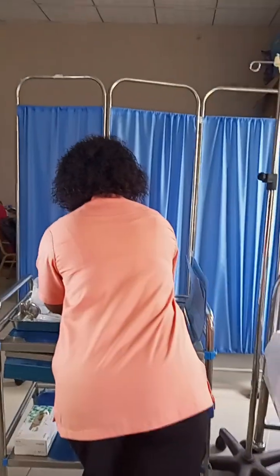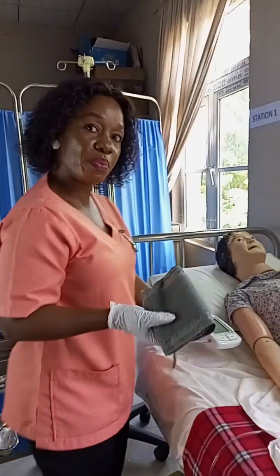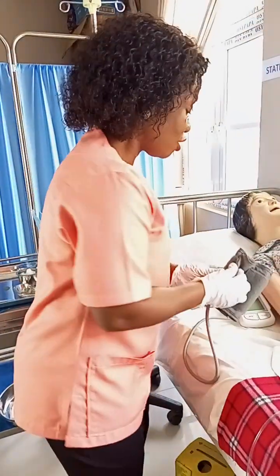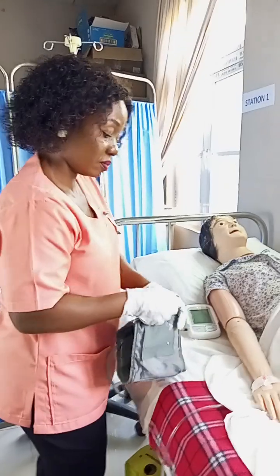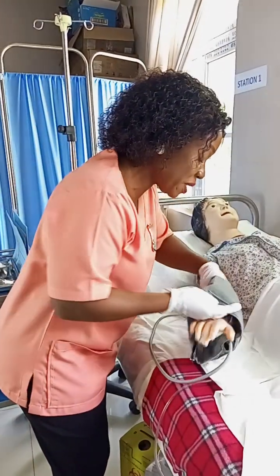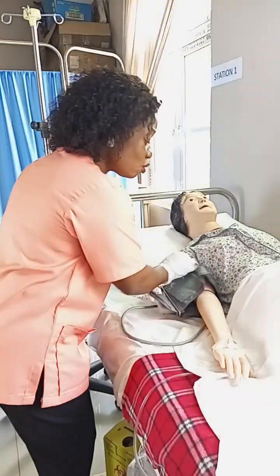The next thing is for me to take my patient's vital signs. Vital signs is very important. During exams, some students forget to put the cuff, the BP apparatus cuff, on the patient's arm, feeling that their time is going. Please do not do that.